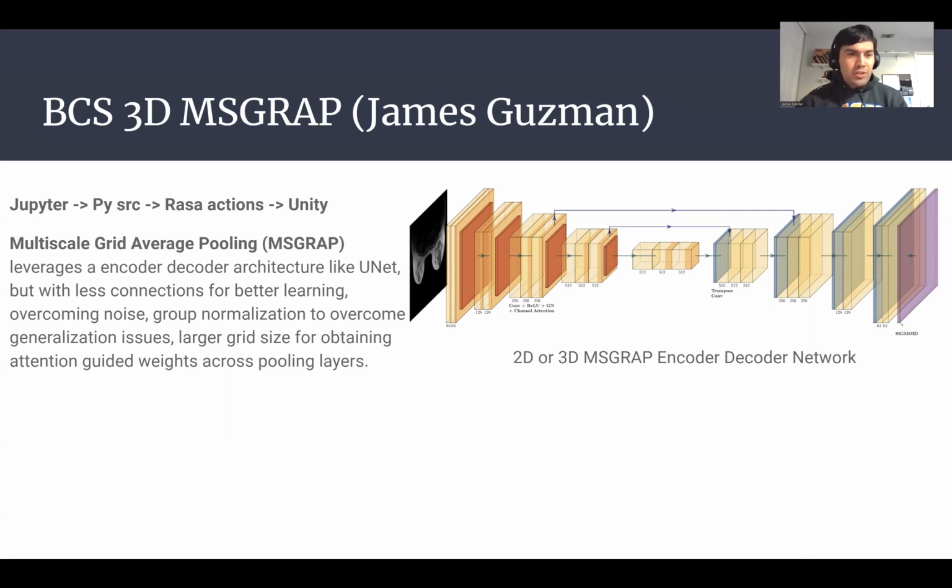It also resulted in overcoming noise often found in ultrasound, MRI, and PET imaging. I actually adapted this model to work with MRI imaging because originally it was working with ultrasound images. The other area I want to explore is working with PET imaging to analyze physiology area of breast cancer.